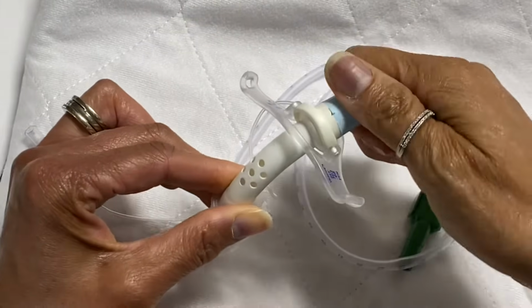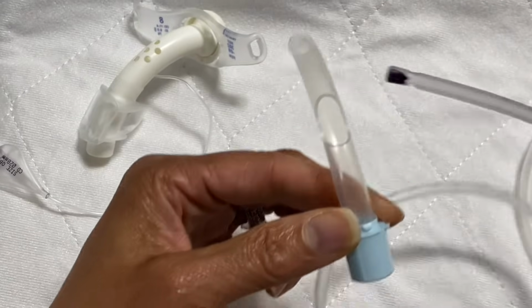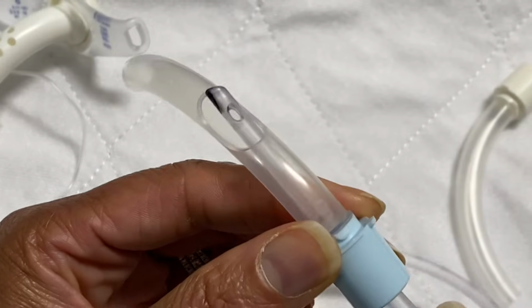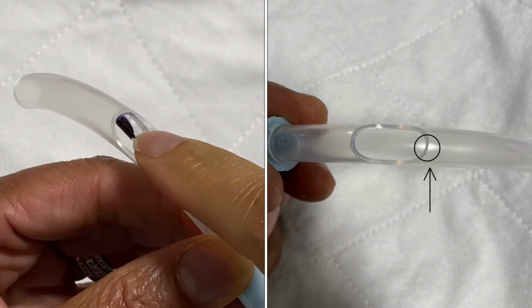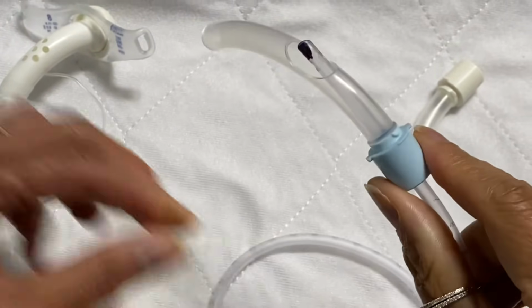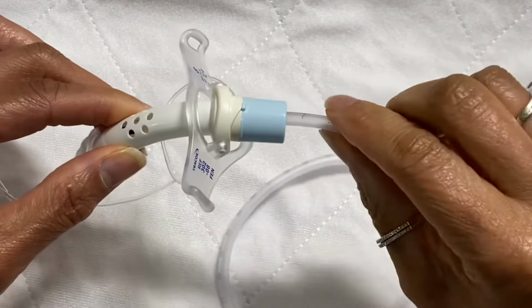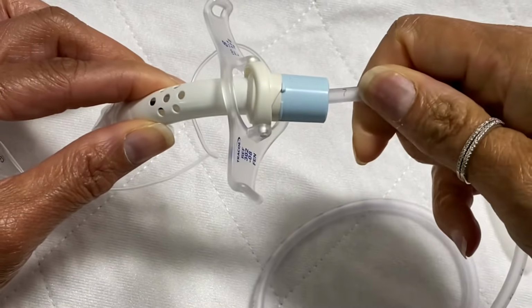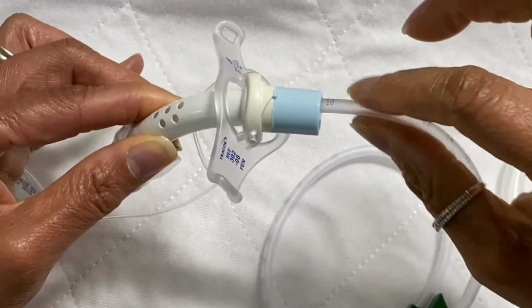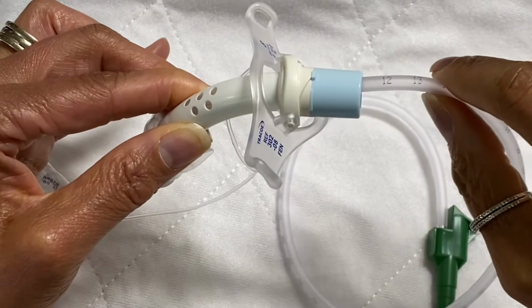Now I want to show you on the inner cannula where that catheter is bumping into the inner cannula when you go to suction your patient. So when you put that catheter inside, your catheter is going up, so it's bumping right here at the lower end of the opening on your inner cannula, and that's where you're getting the resistance. So when you have the inner cannula inside the trach and it's locked in there, and then once you meet that resistance, you just give it a little turn, and as you're giving it a little turn, you just keep allowing a little bit of pressure, and then the catheter will just flow through the trach. You'll be able to feed it through the trach.